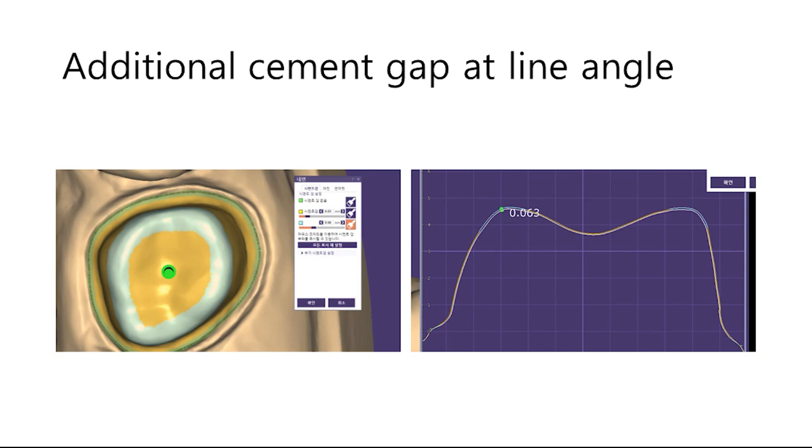This value reflects the machining error identified in the machining error validation and can vary from machine to machine. You should watch this with the understanding that your machine may differ from mine. I purchased my equipment after going through this verification myself. I'd like to say that machining precision is prioritized over machining speed and the price of the equipment.